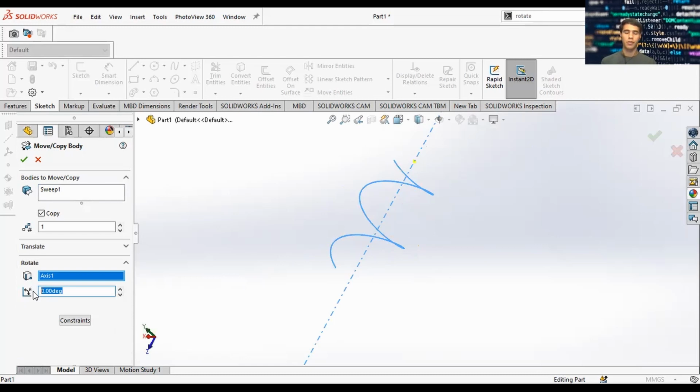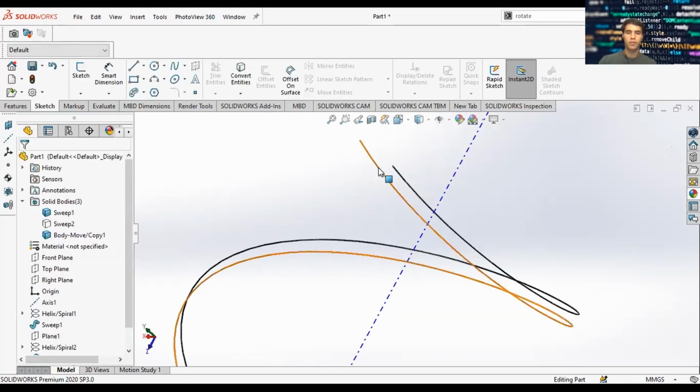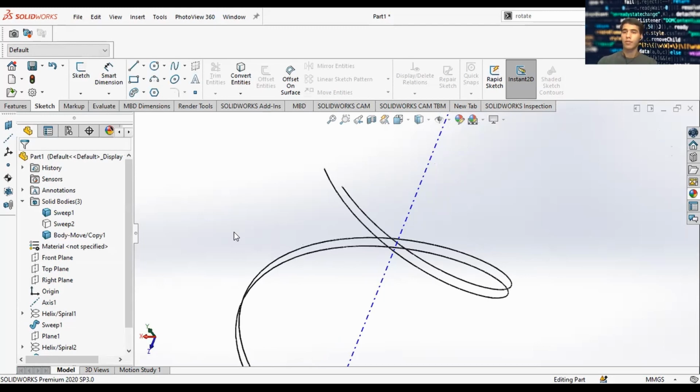So it says in the PowerPoint slides that it's 48 strands. So 360 divided by 48 is 7.5 degrees. And since we're doing strands on both ends, we want 24 of each orientation. So it's going to be 7.5 times 2. We'll add 15 degrees. And you can see there, the original one, and then 15 degrees after you have the second strand. All right. So I'm going to repeat this until you reach the full length of the circle, 360.